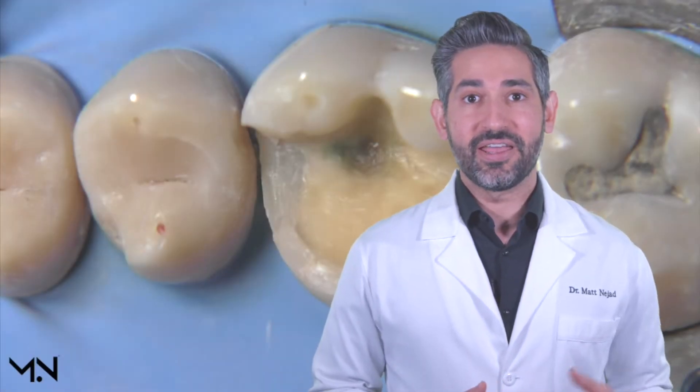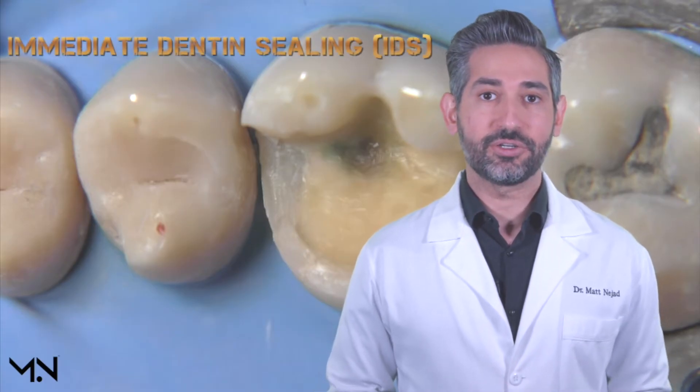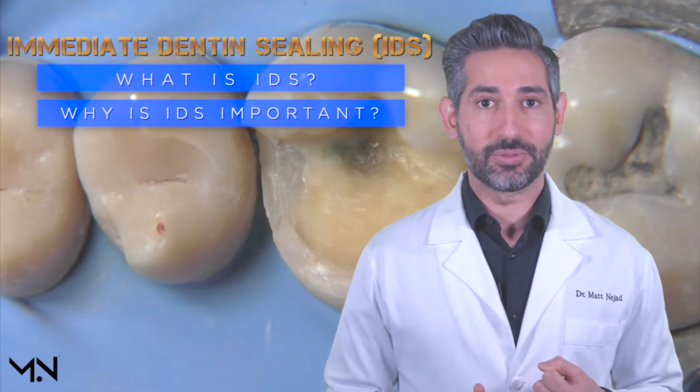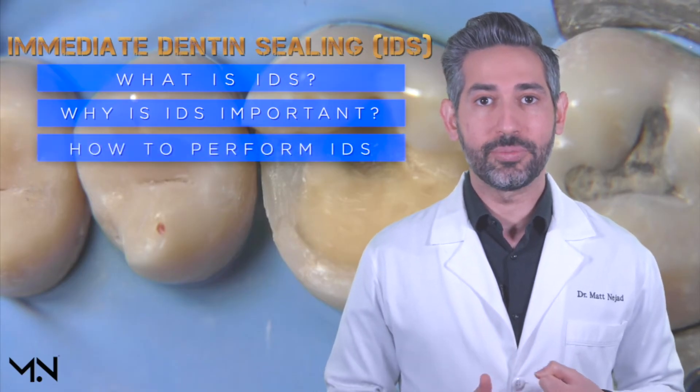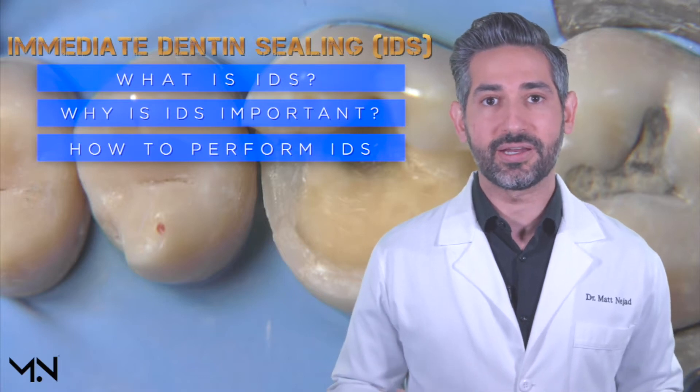Hey, this is Dr. Matt Najad, and in this video we'll be covering the topic of immediate dentin sealing. This includes what immediate dentin sealing is, why it's important, and also how to do it with a video demonstration that shows every step of the technique.